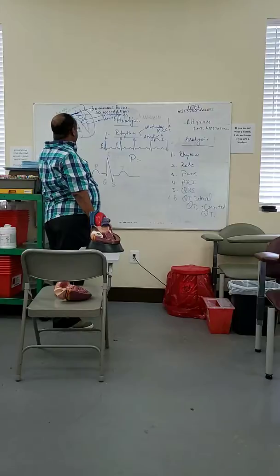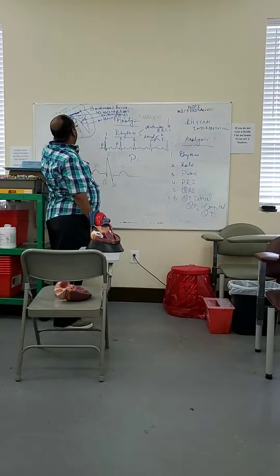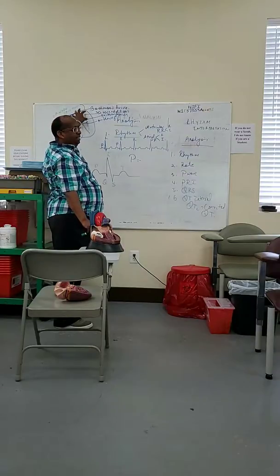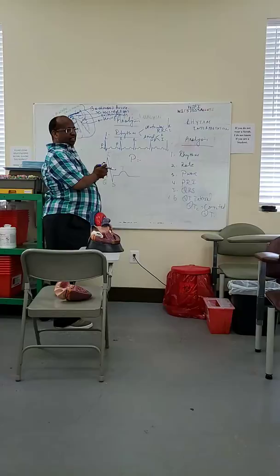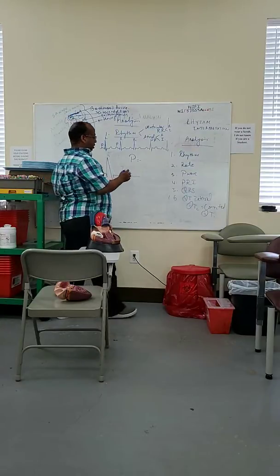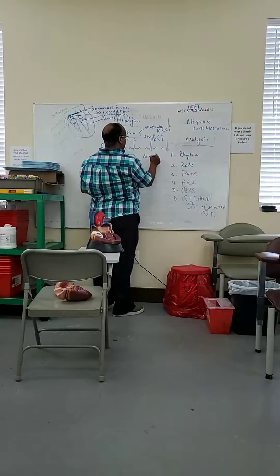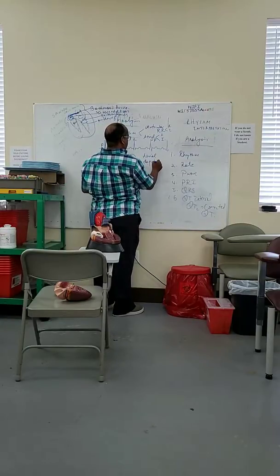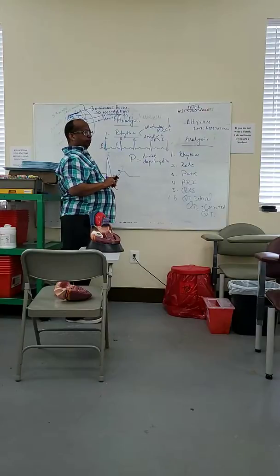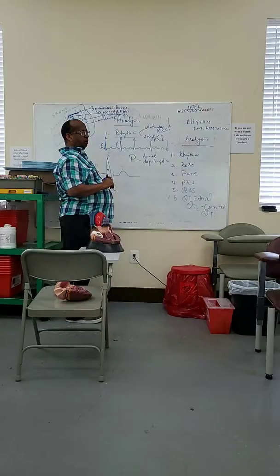Okay? So what does P wave show? P wave shows us when the impulse is coming from where? From the SA node, and then both atria receive that impulse and they what? Contract. Okay? That is what we call atrial depolarization. So that is depicted by P wave. What is the time delay between the SA node electrical shock and the contraction of the heart?